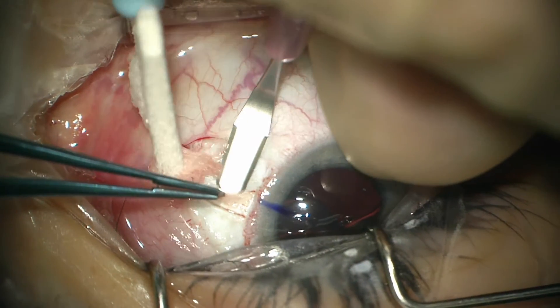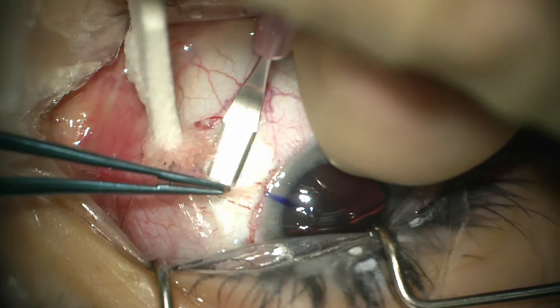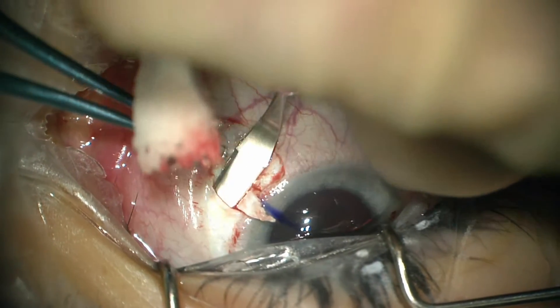Once the flaps are outlined, we go ahead and use a crescent blade to elevate the flaps. And unlike previously, instead of using a needle to make a track for the haptic, I'm using the crescent blade here to make more of a pocket.